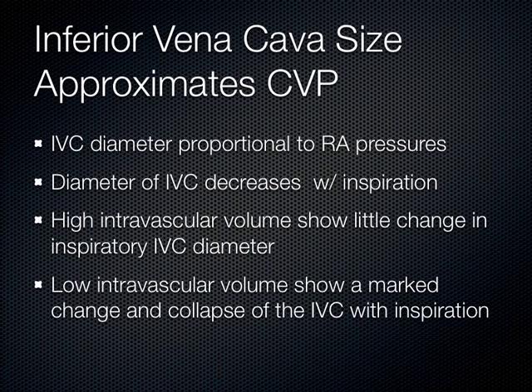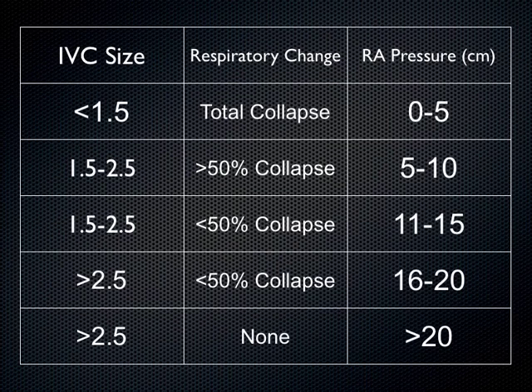That's especially true when you have patients who are in shock, like septic shock. That's where this will play in for you later in your clinical years. But I just want to give you that preamble right now, that you can actually estimate the right atrial pressure non-invasively by looking at the diameter of the IVC and how it collapses during inspiration.